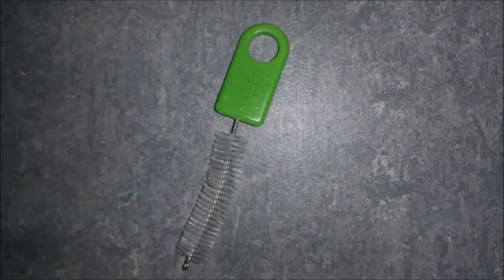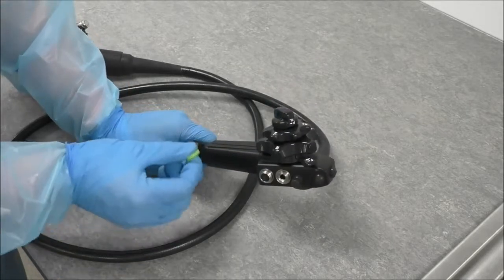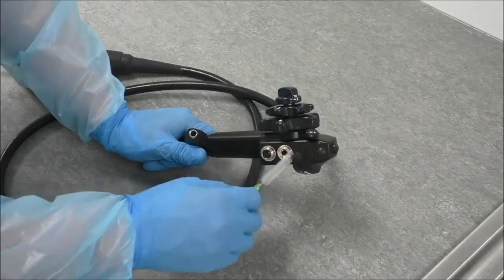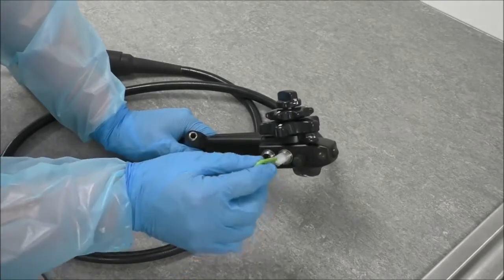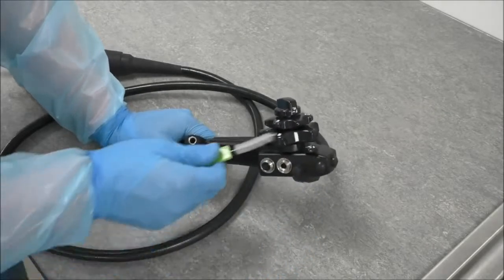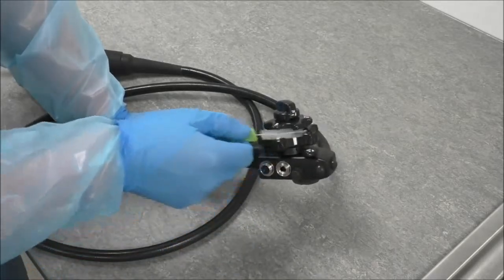Here is a generic channel opening cleaning brush that will be used in the next stage of the reprocessing. Use the channel cleaning brush to clean the biopsy channel port opening, the air and water and suction valve opening, and also around the controls and locks.